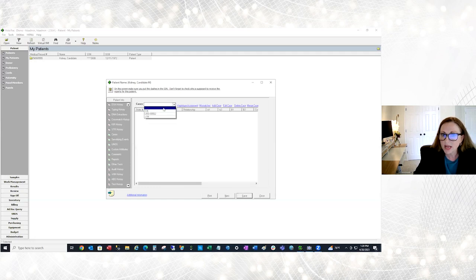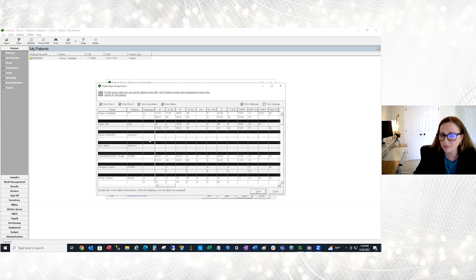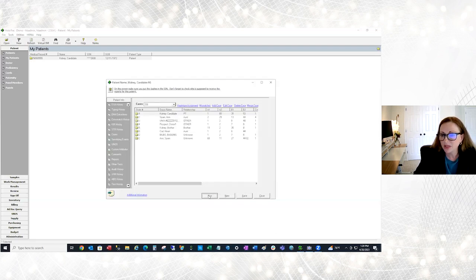Cases is a way within the software to link our patients and donors. And so within that, here is my patient. My brother is down here. And so I am able within my case to make haplotype assignments. So it will display for you the typing for your patients and then these various donors, and you can assign the haplotypes. These haplotypes then can be generated and presented onto a report.